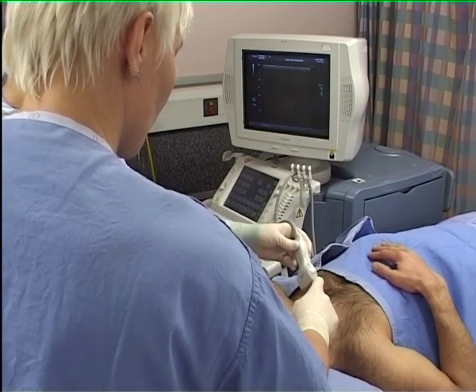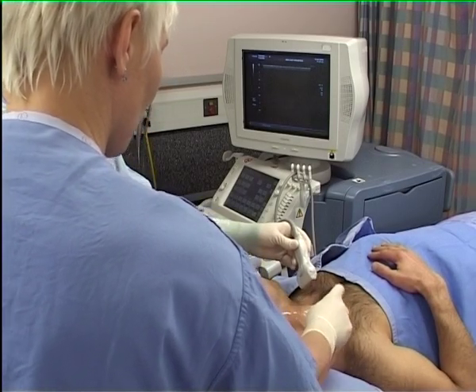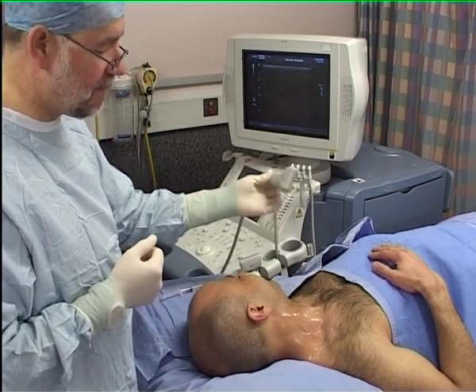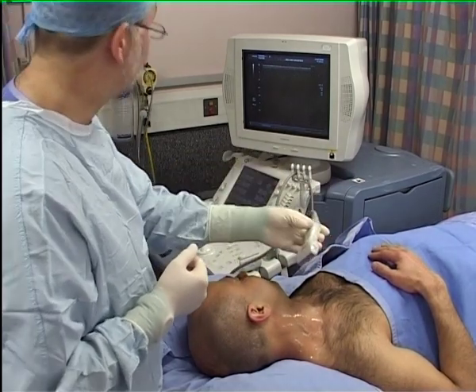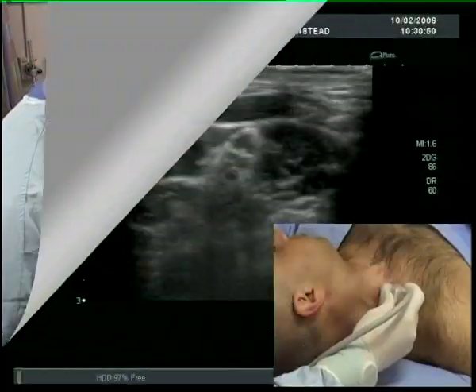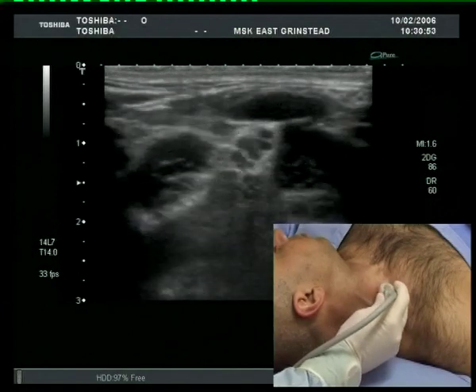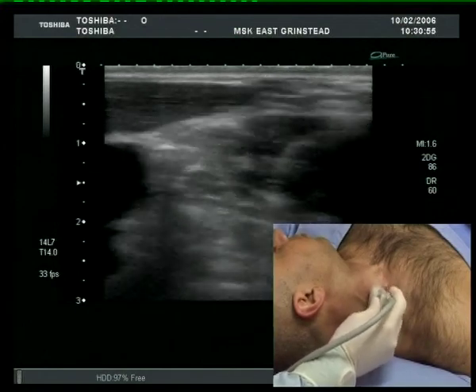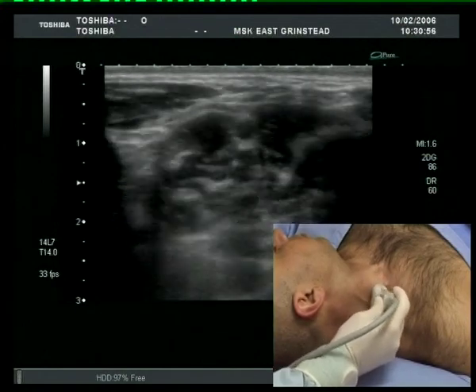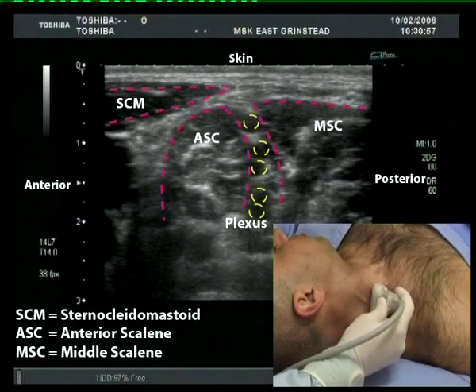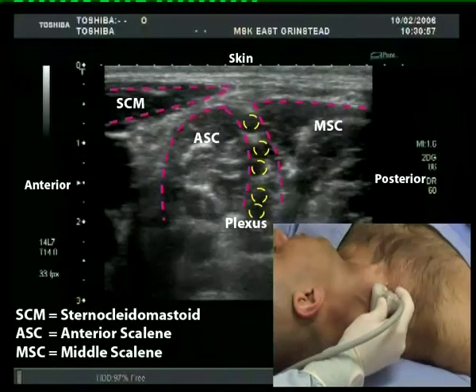Applying the probe near the clavicle allows the subclavian artery to be identified. The plexus lies lateral to it. Tilting the probe into the neck and moving it proximally to follow the plexus leads into the interscalene groove, where the roots appear as round hypoechoic structures between the scalene muscles.